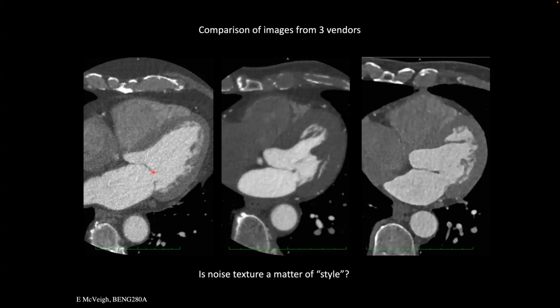Okay, what's up with that one? If I had to pick one, just because it has very good contrast, so I could get most information. Okay, so there's a balance, you can actually see the noise. That's what you're saying, and so now you have an idea of how much noise there actually is.